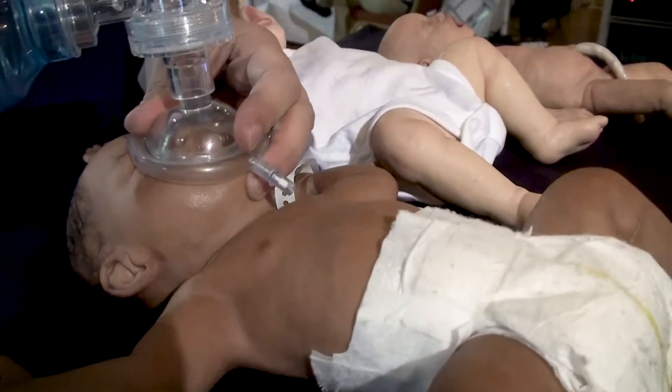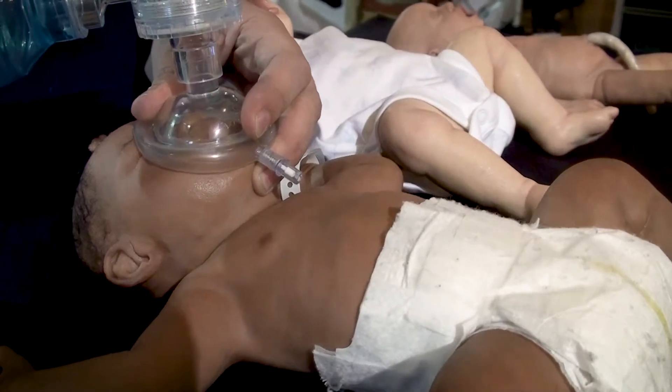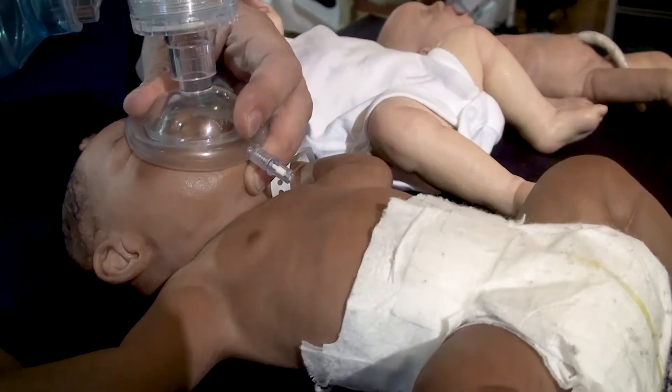Placing the mask on, getting a good seal — can you see that the movement there is as realistic as it would be within the real child?